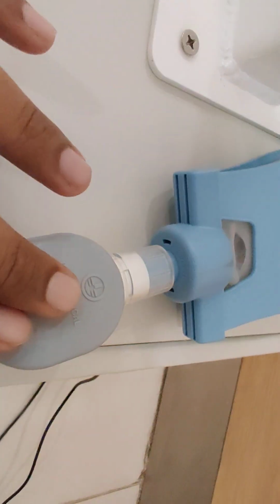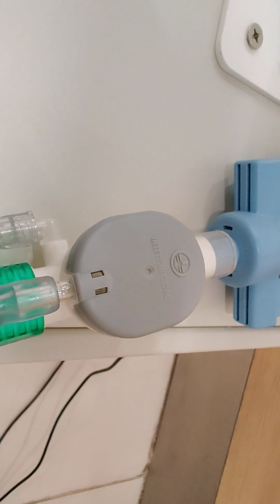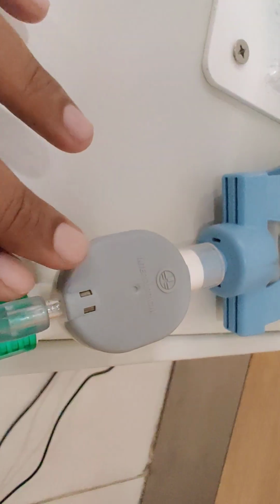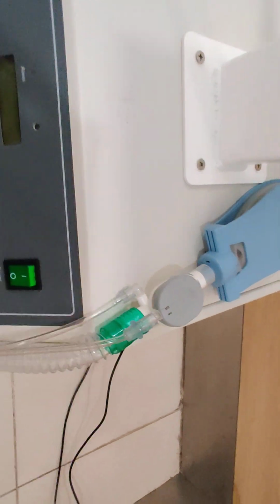So this is the expiratory valve. When the patient is expiring, all the gases will be exhaled into the atmosphere from this expiratory valve, and the opening and closing of this expiratory valve will be decided by the ventilator through this expiratory line over here.